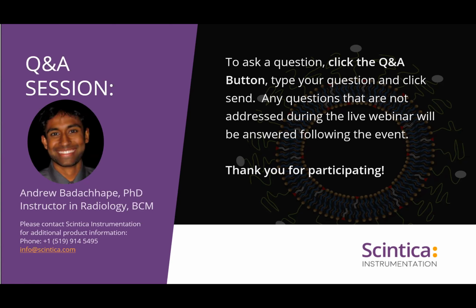We will typically image within the hour of injecting these agents. But another valuable method, given how long lasting the circulatory properties of these agents are, is a delayed post-contrast scan, maybe on the order of days after we've injected the contrast, when we look at tumors. The thinking there is that once it's cleared out of circulation, any contrast that's accumulated in the periphery of the tumor is likely a result of leaky tumor vasculature, which could be useful for better understanding angiogenesis in different leaky vessels.